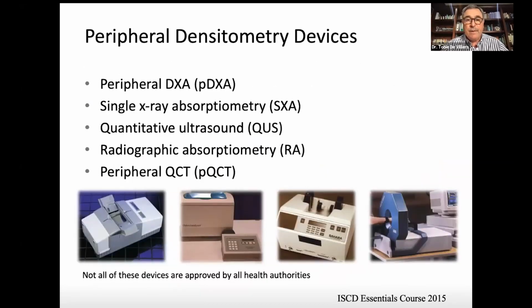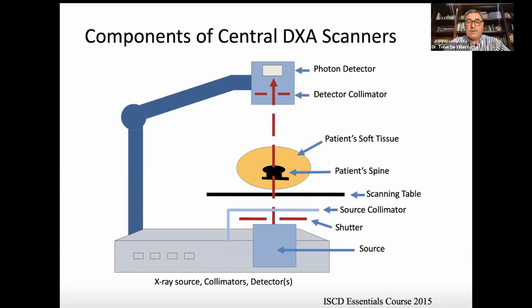There are also some peripheral densitometry devices. I'm not going to refer to them today as they are not the gold standard and generally should not be used to base any decisions upon.